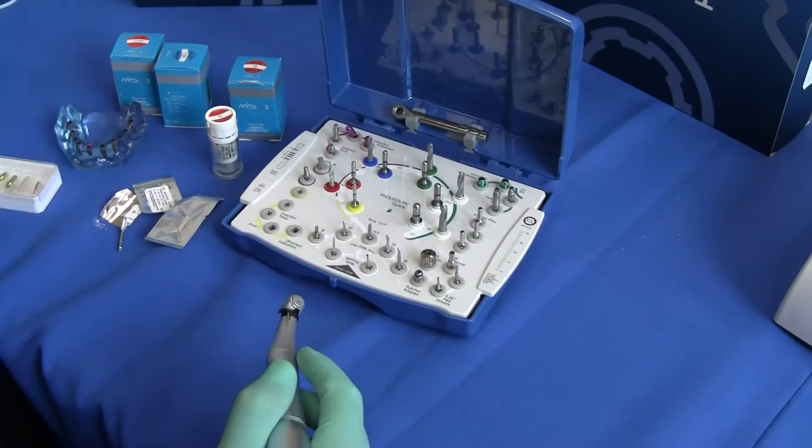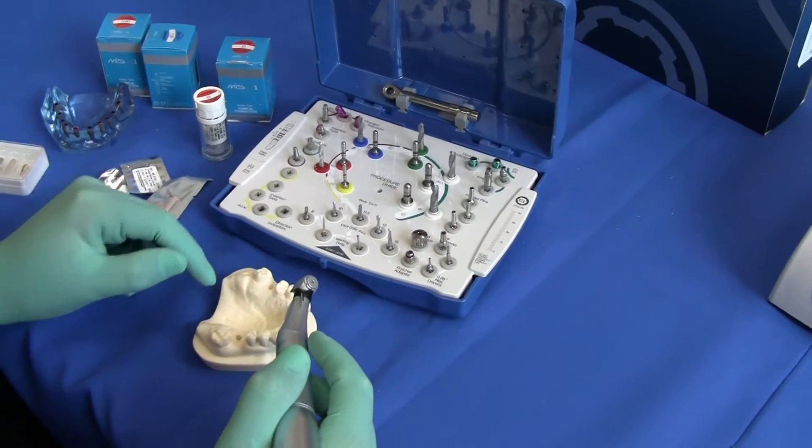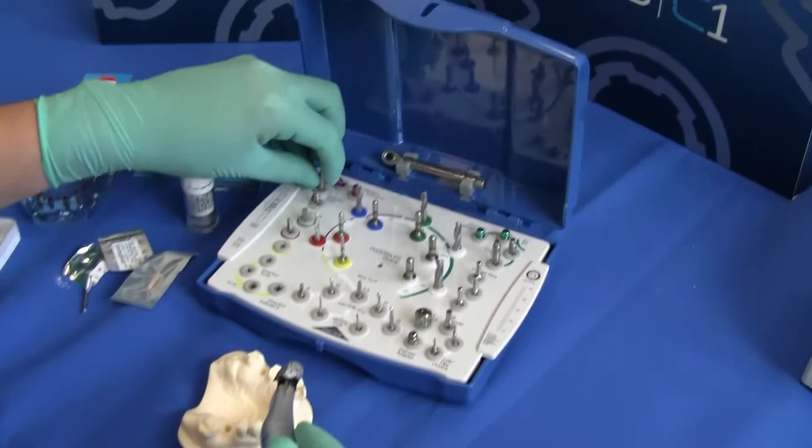Now it is time to place the implant. I can place the implant with either a wrench or a handpiece. I'm going to show both, starting with the handpiece.